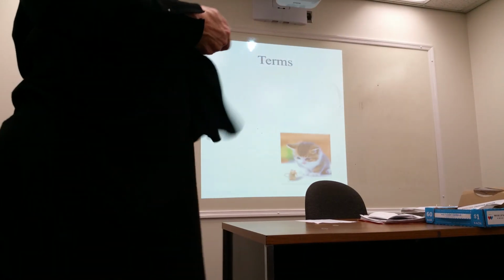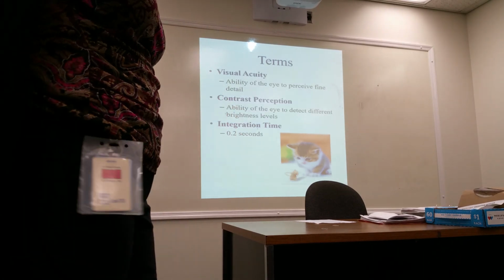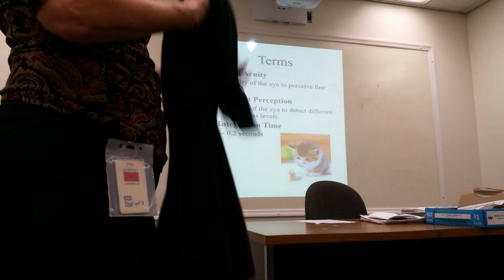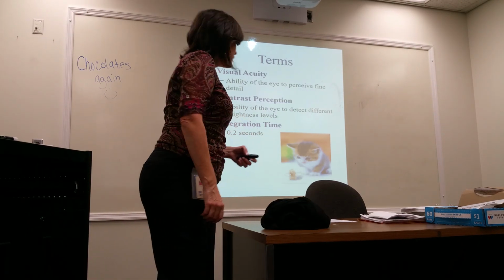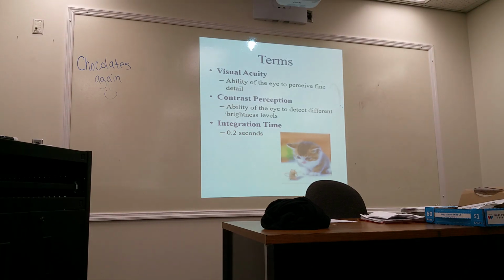Okay, so some terms that we had before. Visual acuity is the ability of the eye to perceive fine detail, then contrast perception, different contrast levels, and then the integration time of the eye is 0.2 seconds. We talked about that before. That means whatever you're looking at on a fluoroscopic monitor, you're going to see within 0.2 seconds. It doesn't get any better.